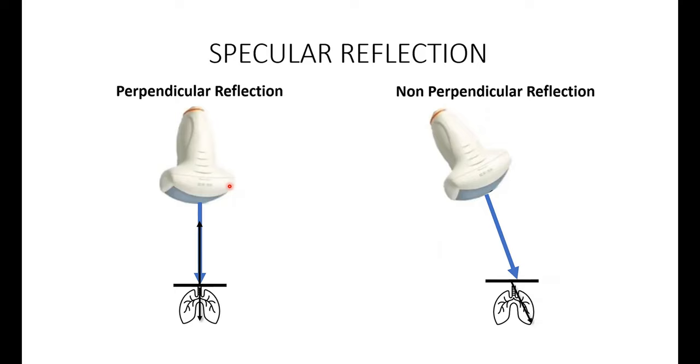Try and optimize that, especially when you're looking at the upper back in a baby who, as I emphasized, is prone. The back tends to slope down. Again, when you go into the axilla of a baby who's supine, there's a sloping towards the axilla. What you might want to do to get that straight is put a small towel underneath to make that area a little more horizontal, so you can get better contact.